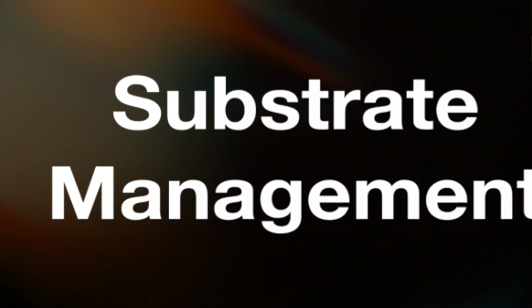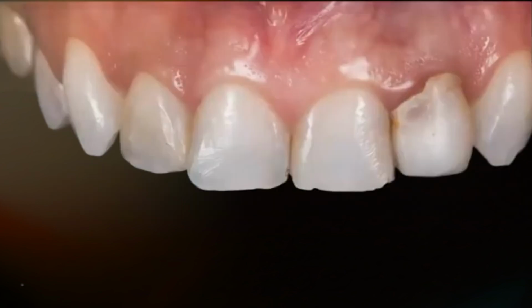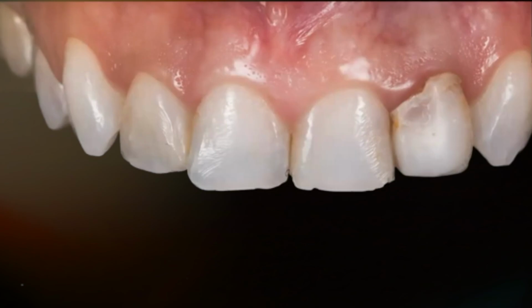However, whenever you have dark teeth or dark roots, there is a problem, because when you work in monolithic, you don't have the optical tool set from layering. So you will be much more vulnerable to this problem than in analog. And there are three ways you can overcome this problem. So again, remember that one way can depend on the technician, and this is by staining the ceramics.